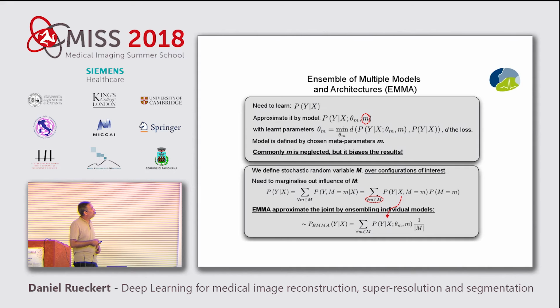And the idea is very simple. For example, if I take this FLAIR image, I have a manual ground truth segmentation. If I now train my neural network using cross entropy or Dice as a loss function, I'll get different results. And I don't really know which one is necessarily the best one.